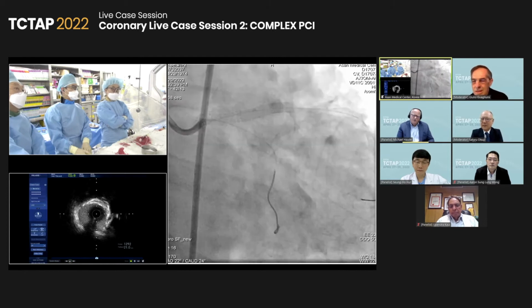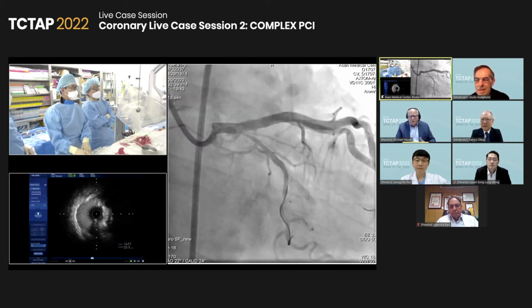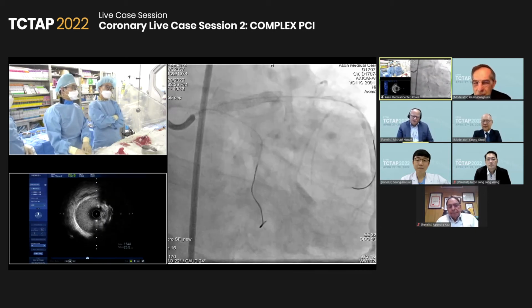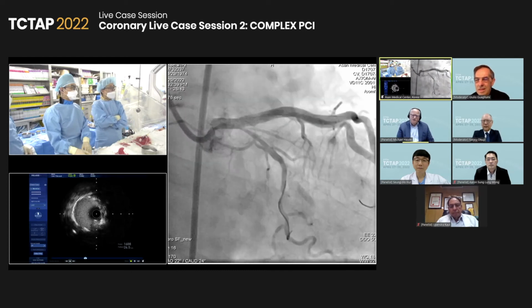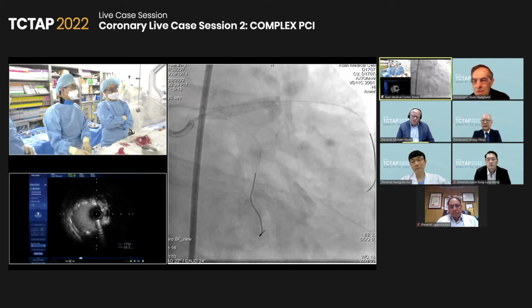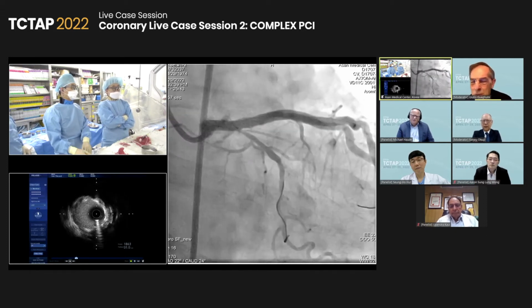Then if you want to be conservative, you look angiographically. If you want to be more thoughtful, you go in by IVUS and see what it tells you, whether there is now a dissection, plaque shift, or compression of the lumen there, then you will probably change to a two-device strategy.